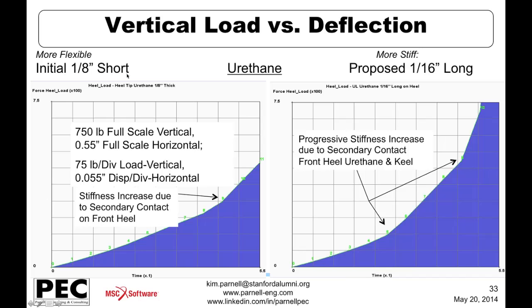So we have the thicker, shorter urethane pad heel component on the left side. We have the thinner, longer pad on the right side. And vertical scales are the same. These both go to a peak of 750 pounds. And the horizontal scales are also the same. We've loaded them both through the same full-scale displacement, 0.55 inches.